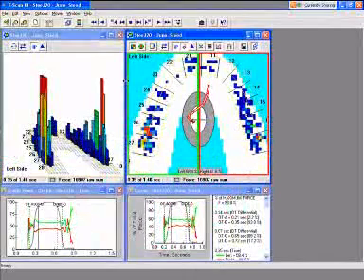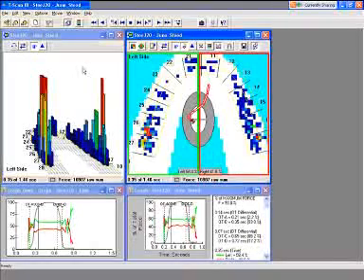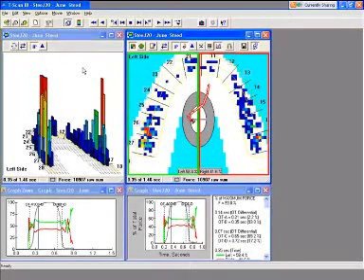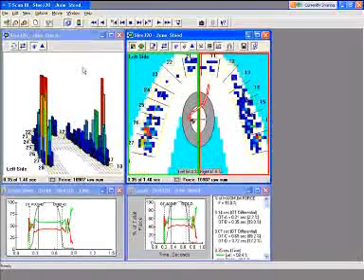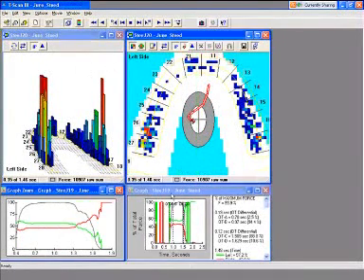So I just did right and left lateral excursive movements and a protrusion. So basically that, I don't know what the timing on that was. Well, we could check when I go to save the movies. It was less than 30 seconds. So it really is not going to be something that takes away from what you're currently doing. It's just going to only add. And you don't have to spend hours explaining all of this to the patient.